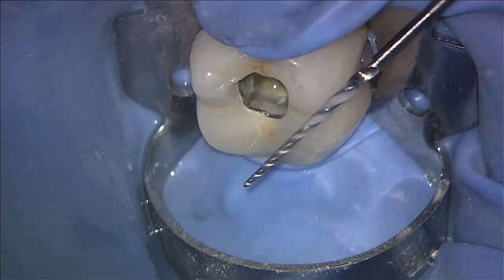We can see the advantage of the hybrid technique in using the very sharp blades to rough cut the prep and finishing with safe landed blades.